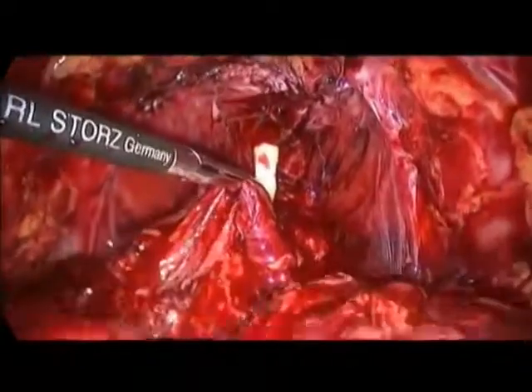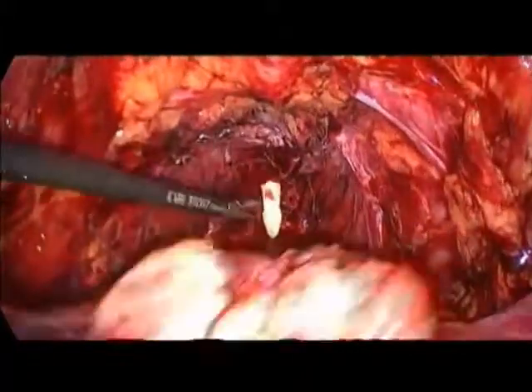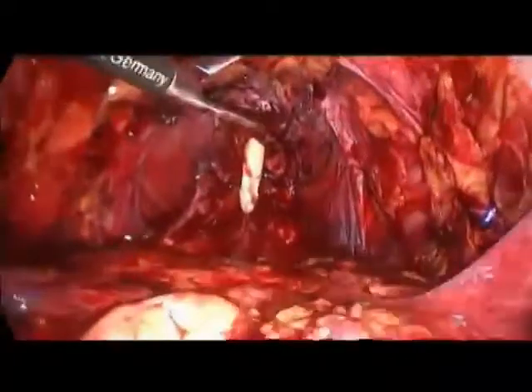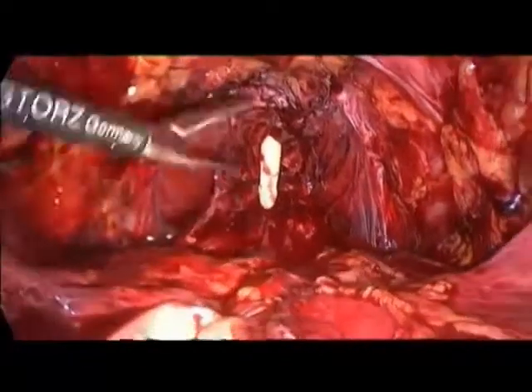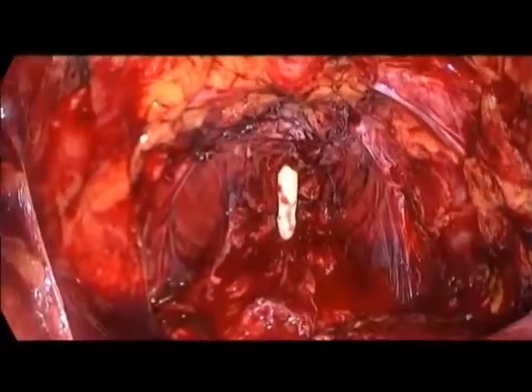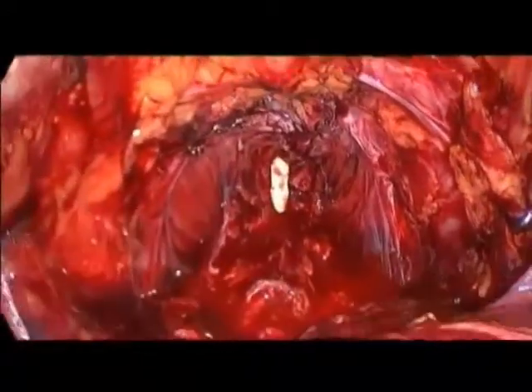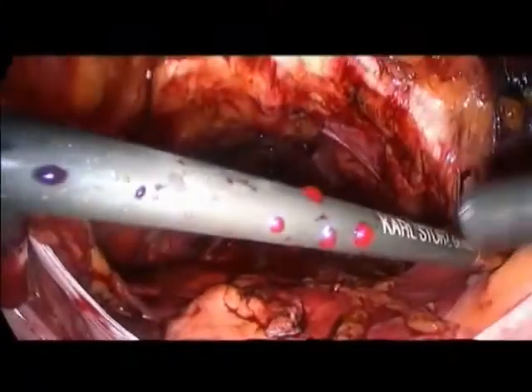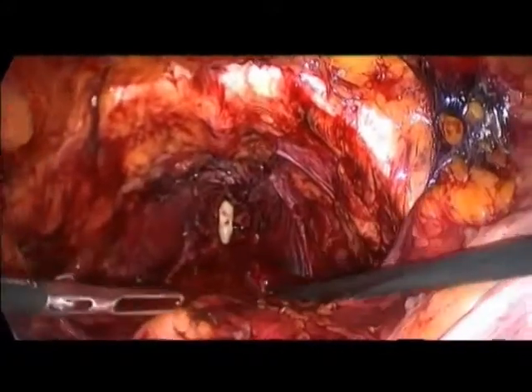Roland? Yes. About time of extraction of specimen. Do you use to remove it before anastomosis? Generally I leave it for the end, but here there was an exceptional demand for having the margins immediately. Okay, so you are waiting for results of frozen section? No, not yet. We will do a stitch in the midline with this one.